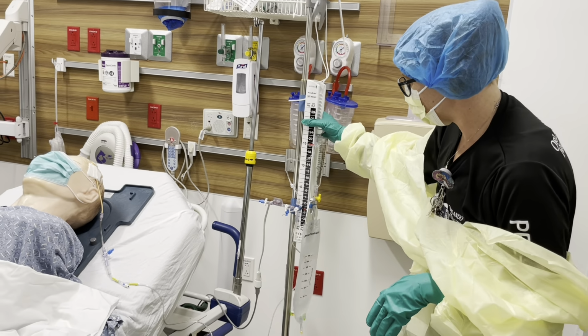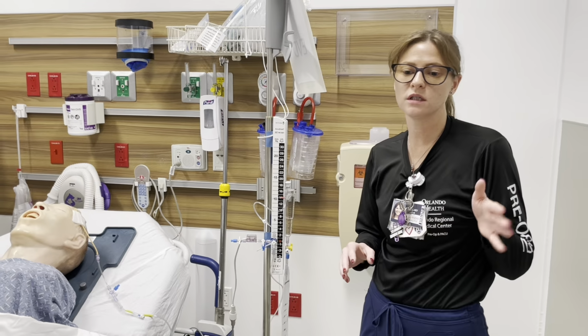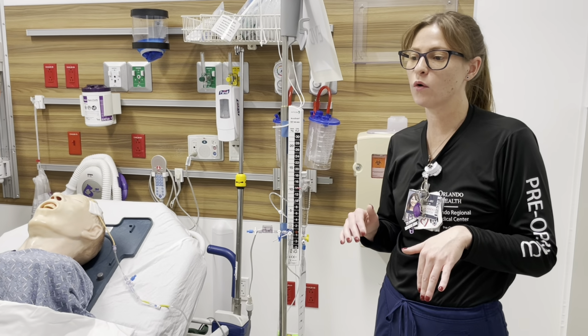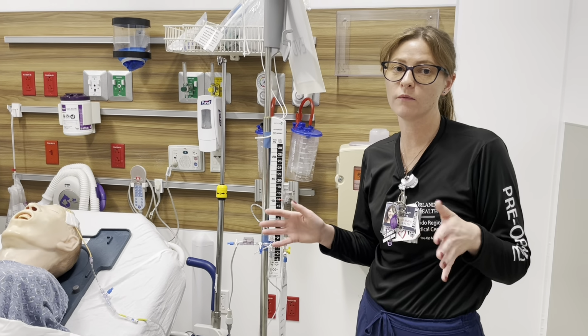So at this point, our patient is still clamped because we just set this up. ICP is going to be between 0 and 15. Everybody's going to be a little bit different. When they first come out of the OR, it may not pick a great ICP up because maybe they've drained a lot of fluid in the OR. Typically, if it was put in at the emergency department bedside, you're going to get some type of ICP.